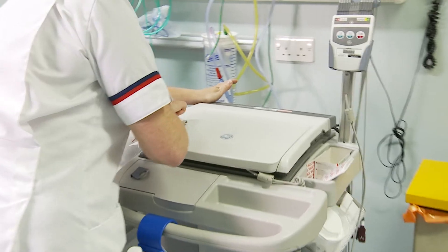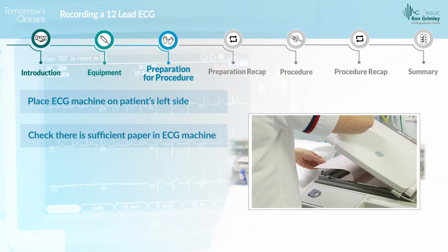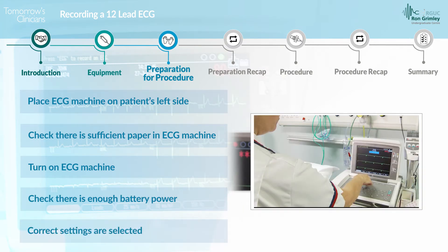You are now ready to prepare the items you'll be using. Place the ECG machine on the patient's left side. Check that there is sufficient recording paper in the ECG machine, then turn it on. Check there is enough battery power and that the correct settings are selected.